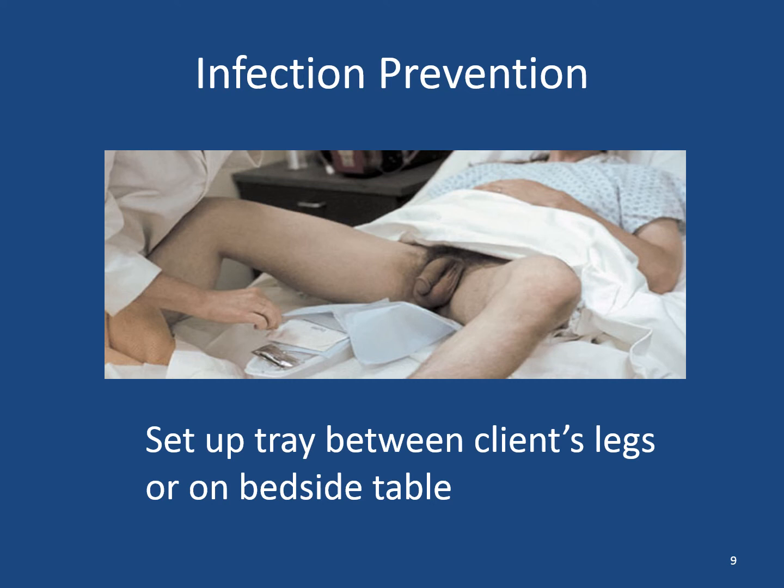So set up your equipment. Most of the time we'll set it up between the client's legs or on a bedside table. If you're unable to set it up on the client's bed, because let's say they're uncooperative, they're moving their legs a lot, then sometimes you set it up on the bedside table and have it right next to you so you can even pick it up, move it quick between the client's legs and place your catheter.